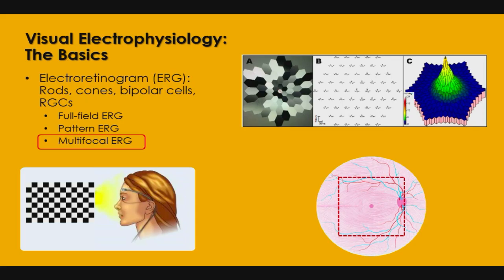Now, if you think of the visual field test, you are able to localize areas of discrete defects or lesions. So this idea was extended to the ERGs, and they tried to do this stimulus. It is not exactly like what I show you here. It's more like this than that, but I couldn't get this one to animate. So I'm just using this, but you will see this. And you can see that these have a hexagonal shape instead of a square shape.